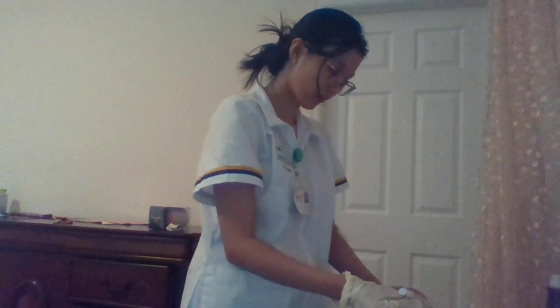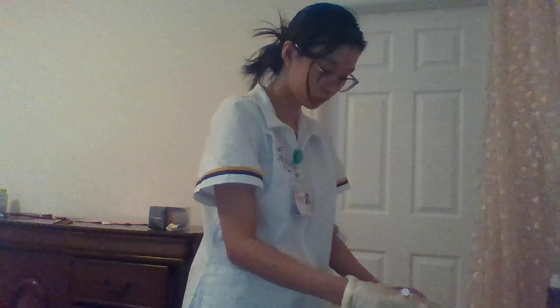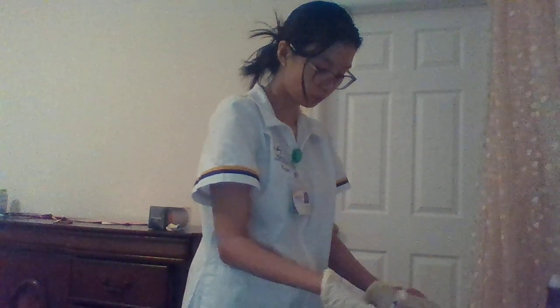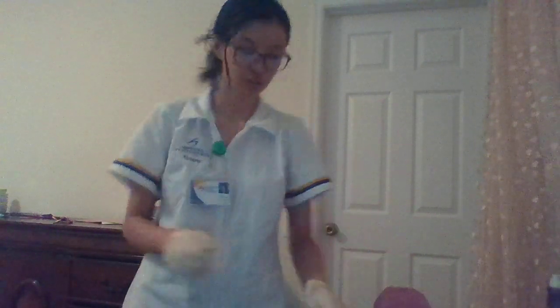And after that, I am gonna remove my hand. I'm gonna remove my needle and then release my hand and engage the safety on the needle and dispose of it into the sharps container.